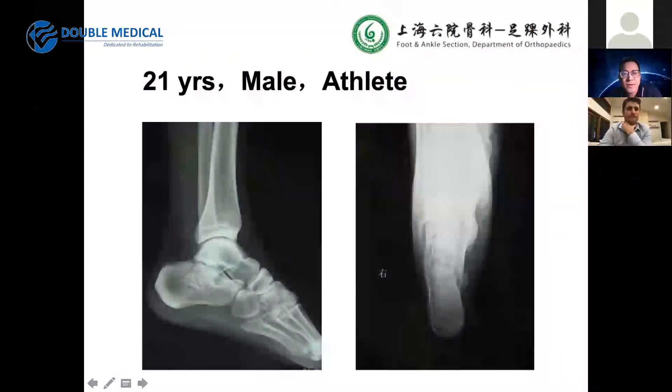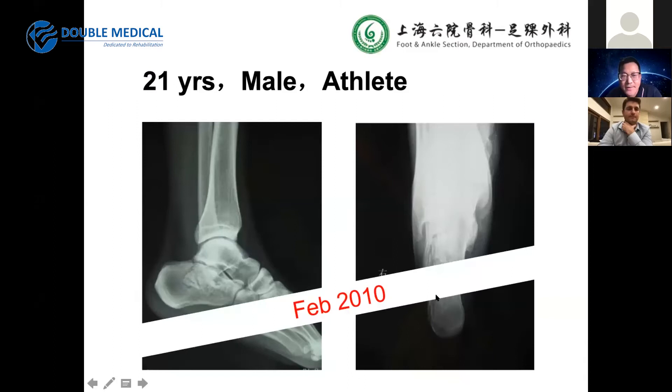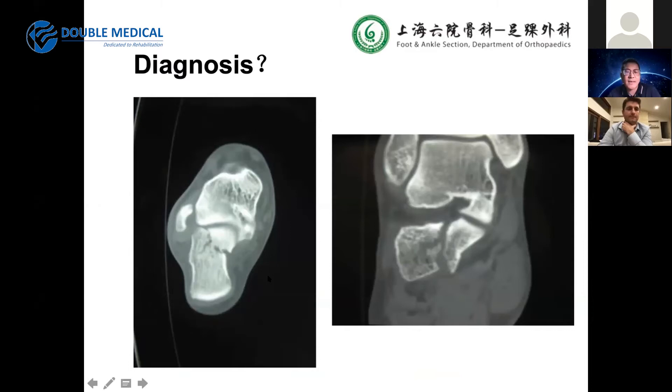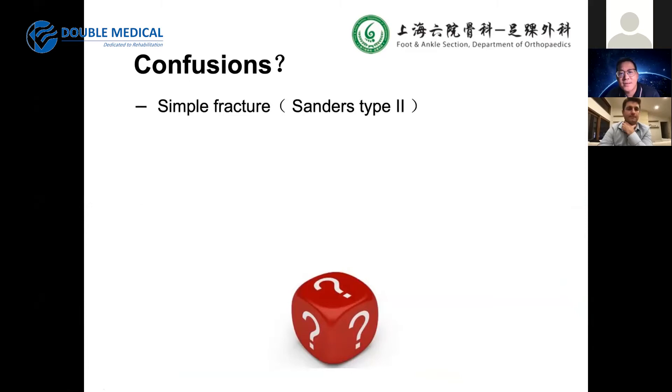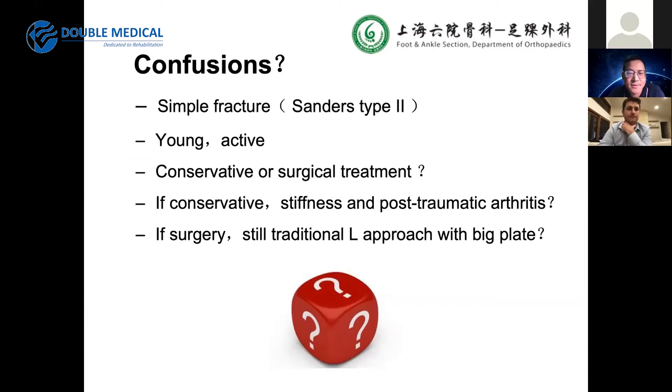Here is a 20-year-old male, a young athlete. From the lateral view, we found an intra-articular fracture with alignment that was not too bad. On the sagittal view, we found a depression fragment. This appears to be a Sanders type 2, maybe type 2A. For a young, active patient, what treatment should we choose — conservative or surgical? If conservative, what about stiffness and post-traumatic arthritis?